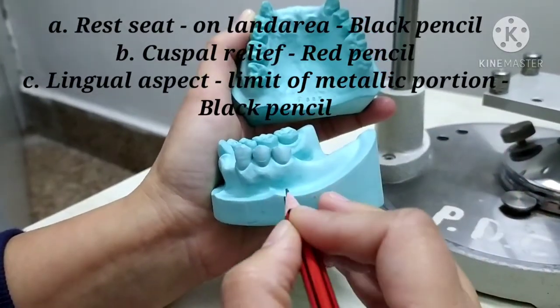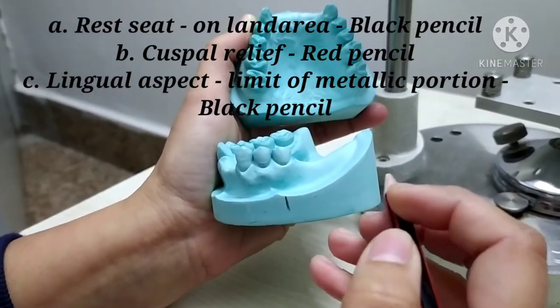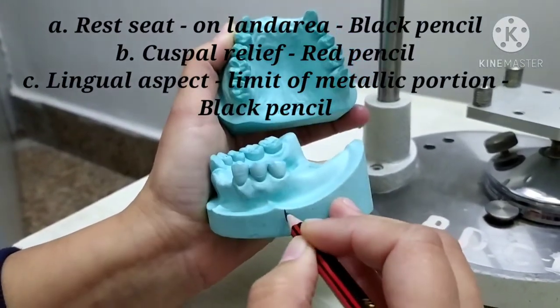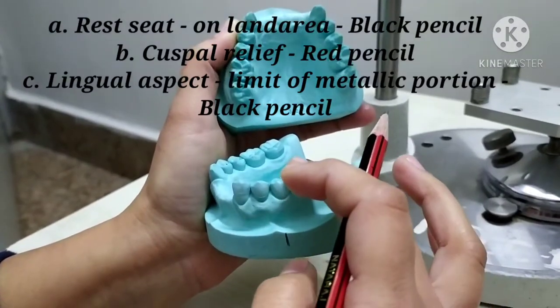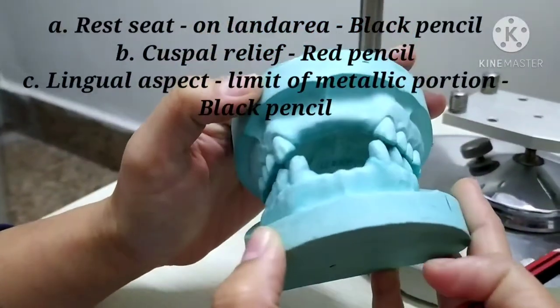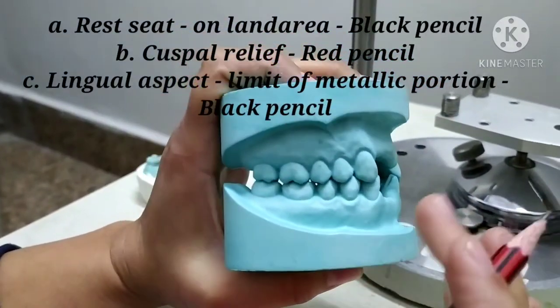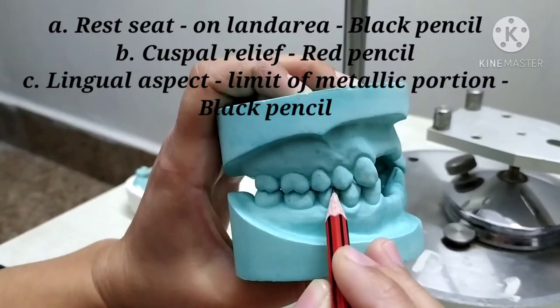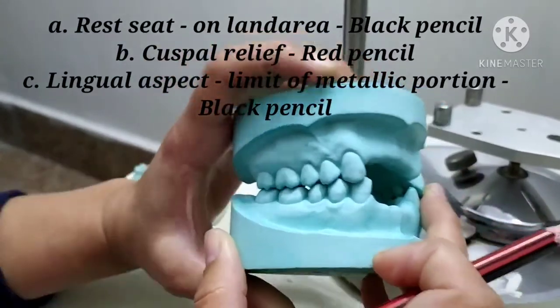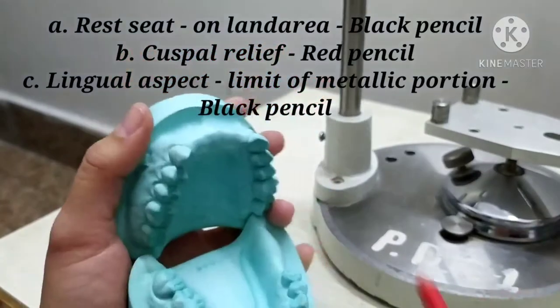The significance of marking this line onto the land area is that if in any case we are going to change the placement of the rest seat, then this line can be easily scraped off without altering or changing the tooth structure. The second thing to note with the occluded cast is to check any interferences present during occlusion. For example, if the lower second molar mesiobuccal slope is interfering with the upper tooth for proper occlusion, then that area has to be outlined with a red pencil.